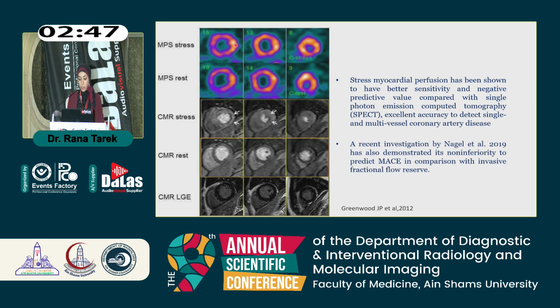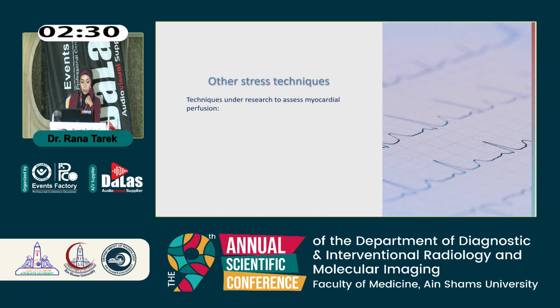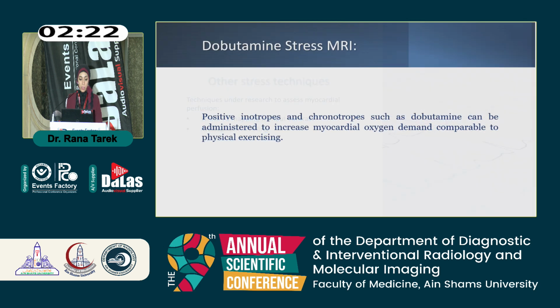And also, as recently published, the stress perfusion has demonstrated its non-inferiority to predict the major cardiac events in comparison with the invasive fractional flow reserve. Other stress techniques are still under research. I will just mention them: stress T1 mapping without contrast and arterial spin labeling.